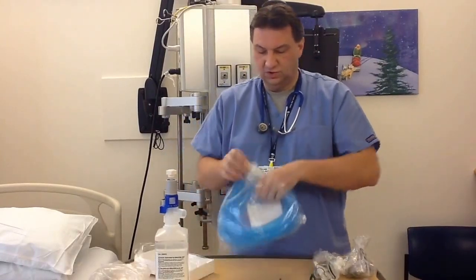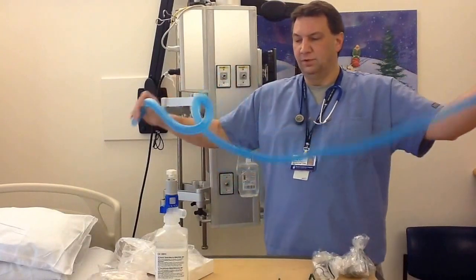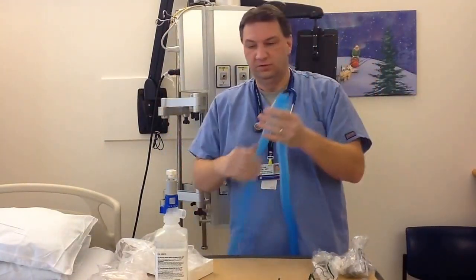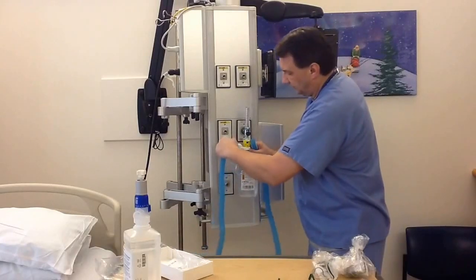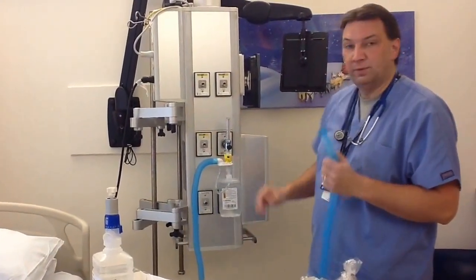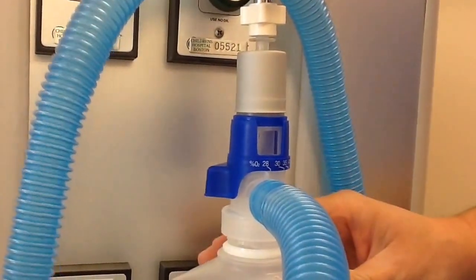Alright, so once we connect the nebulizer portion, we need to connect large bore tubing to it. So this is the blue large bore tubing that's available on all the nursing units. And what we do is we just insert it, it only fits one way, to the output chamber on these nebulizers.